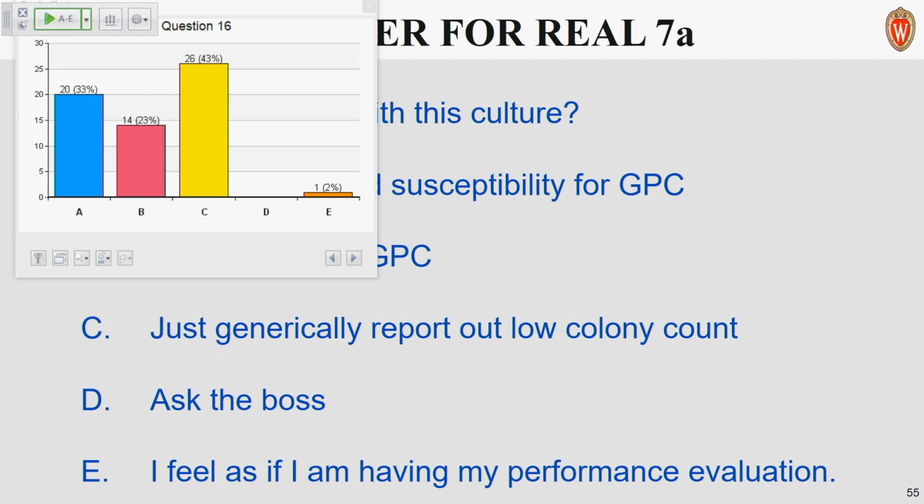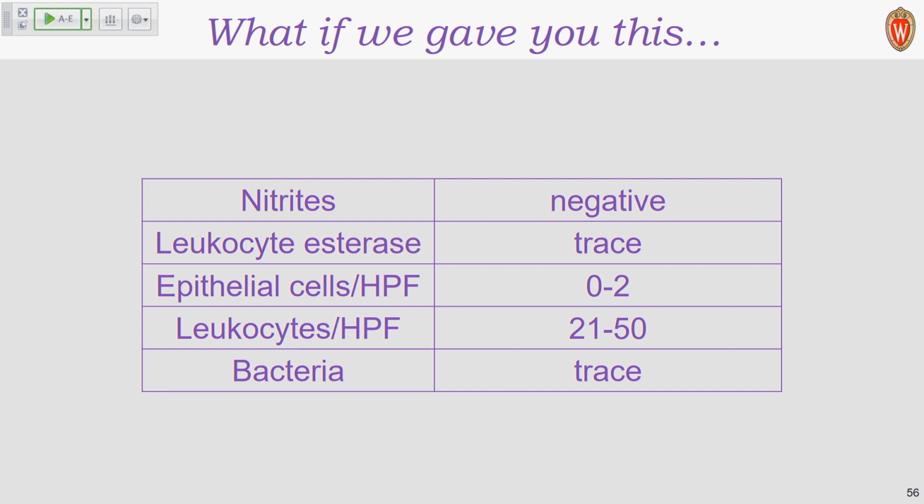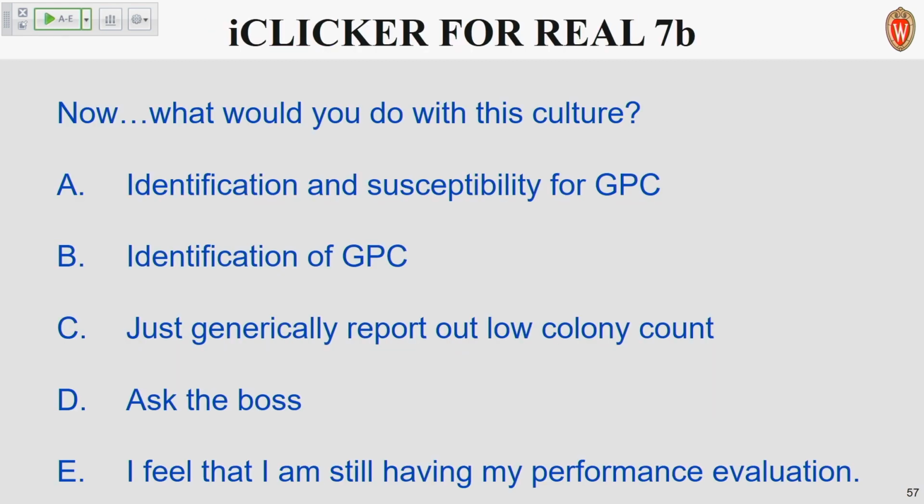All right, we got quite a mix in A, B, and C there. But we had some people identifying, correct? Yep, at the very least, a few. Okay. Great. Holy cow, look at all those leukocytes. All right, now what do you do?